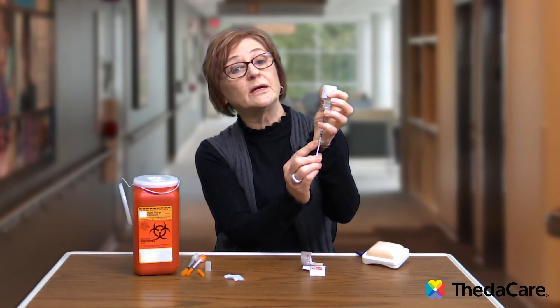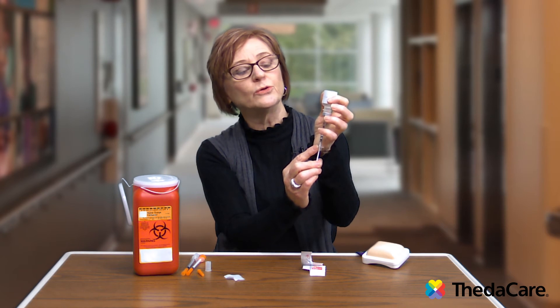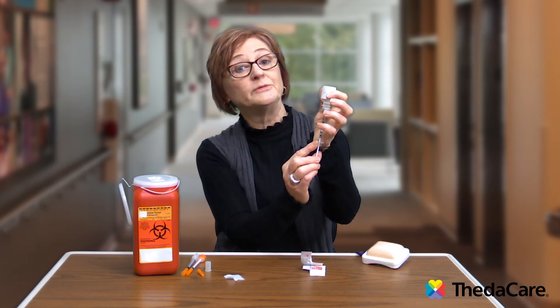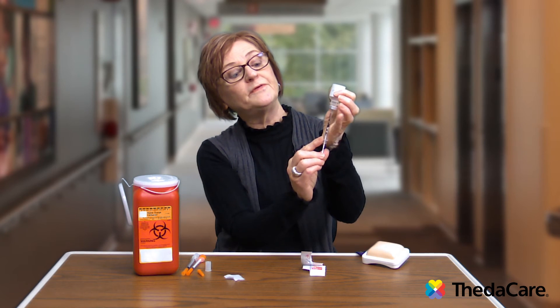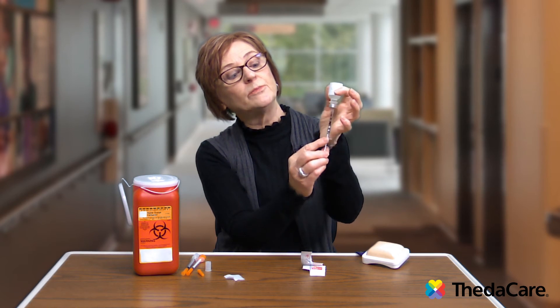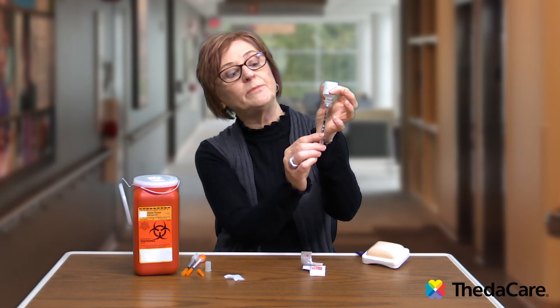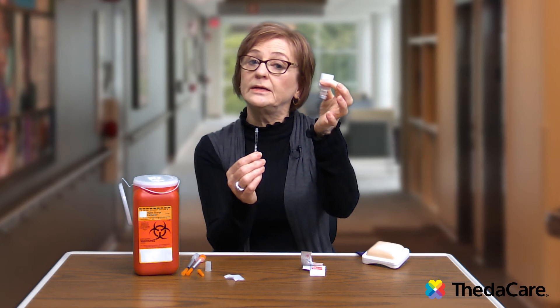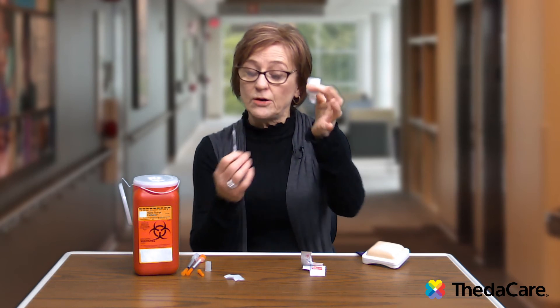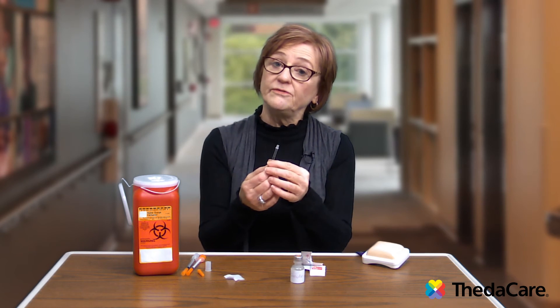Air bubbles take up space — they're not going to hurt you, but you wouldn't be getting the right amount of insulin. Once you confirm there are no air bubbles, line the tip of the plunger up to 15, then pull your needle out. The vial will seal itself, and now you're ready for your injection.